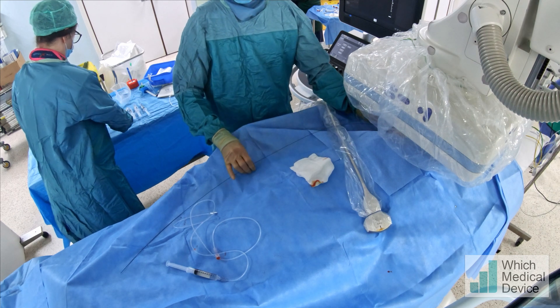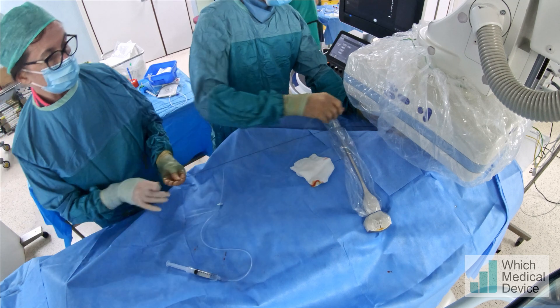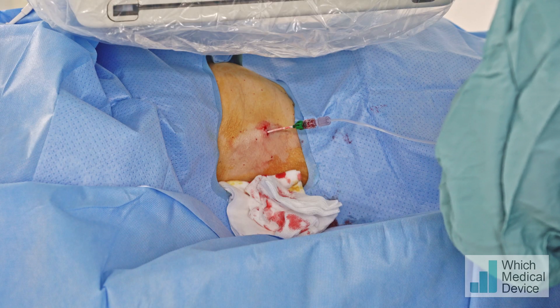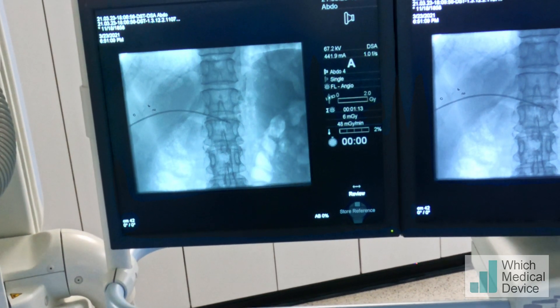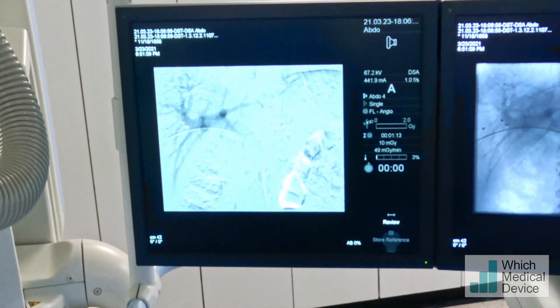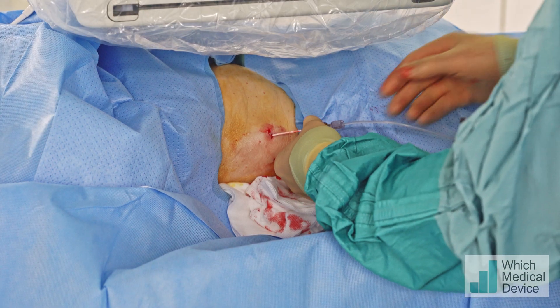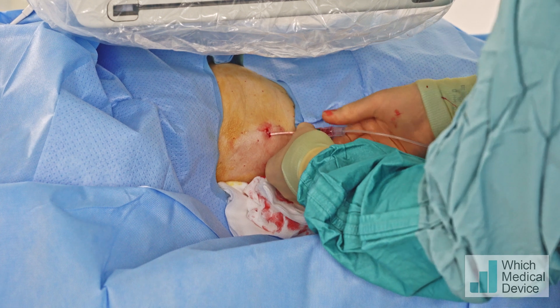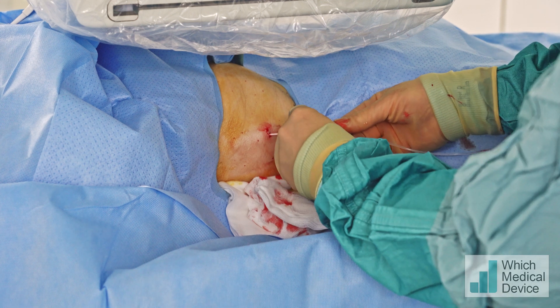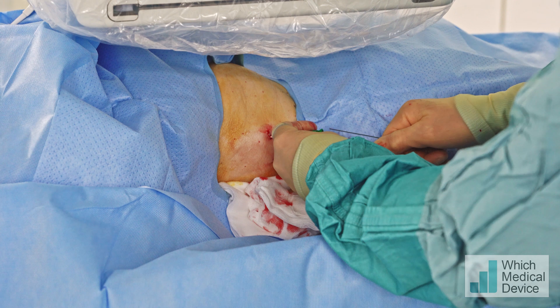We'll take the wire out and just do a little run there. And breathe away. We've got good access down the main part of the portal vein. What I'm going to do now is exchange over the Benson wire for a seven-French sheath, which will give us better flow to infuse the islet cells.